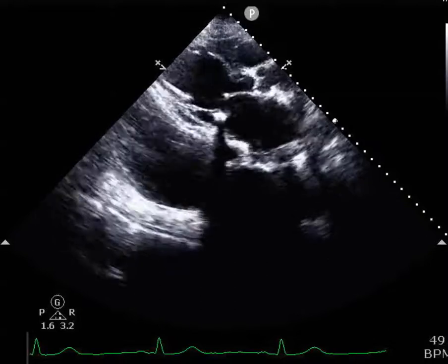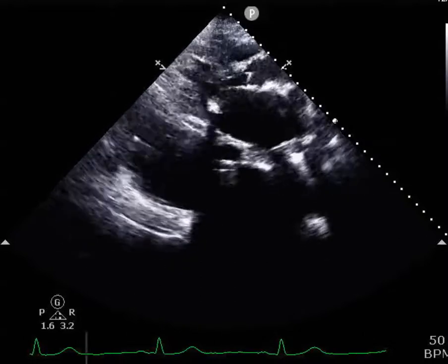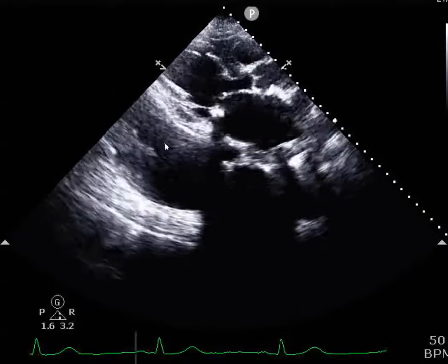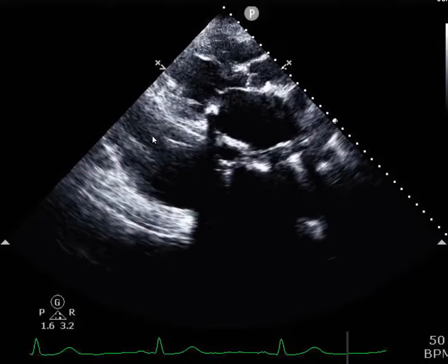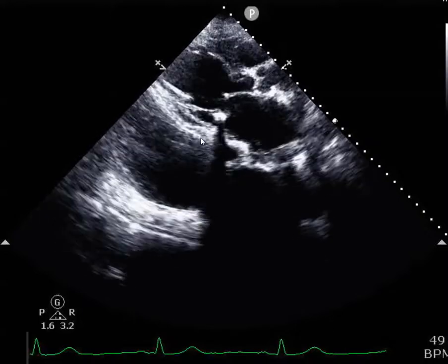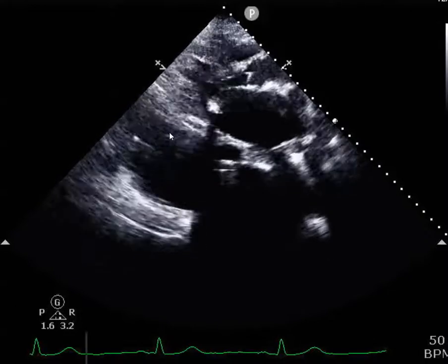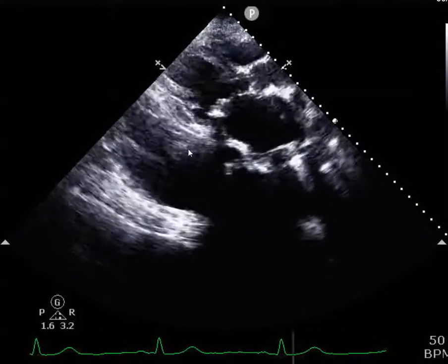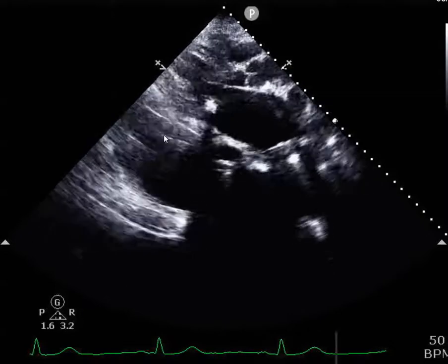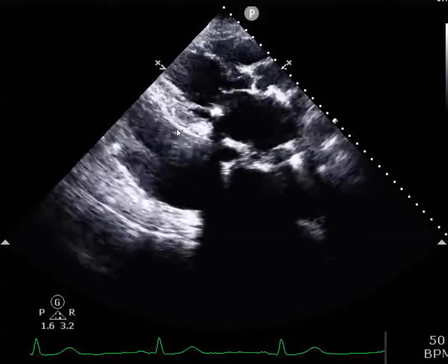I always say you can see a lot from an initial parasternal long axis view. So here's a parasternal long axis view, and what's interesting, I will point out, is an artifact line here, most likely a reverberation artifact coming from the pericardium. A very highly reflective surface, such as the pericardium, can cause a reverberation artifact, which we'll talk about at a separate time. So that's a very good example. And one clue is it's moving exactly in synchrony with the pericardium.